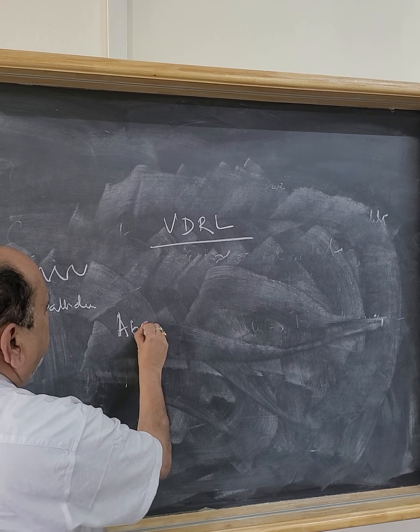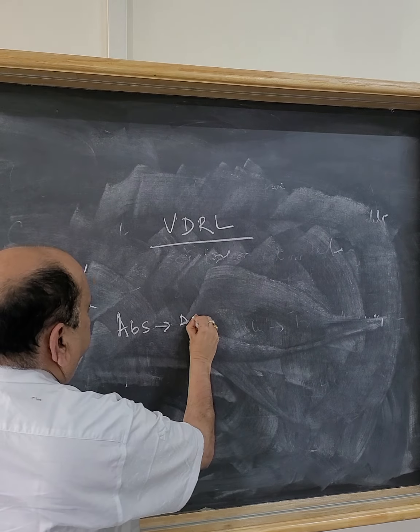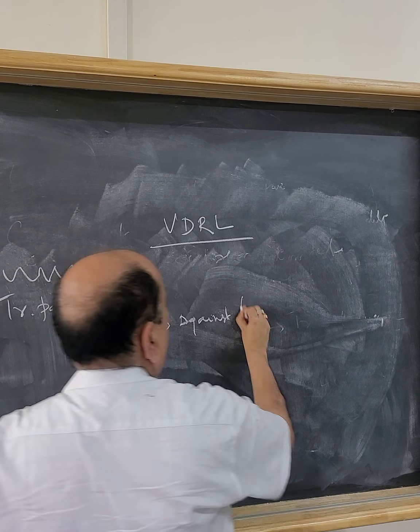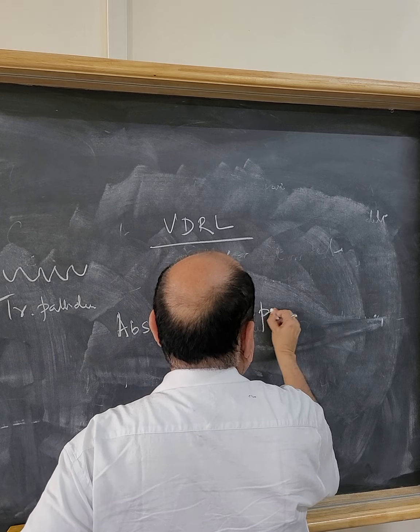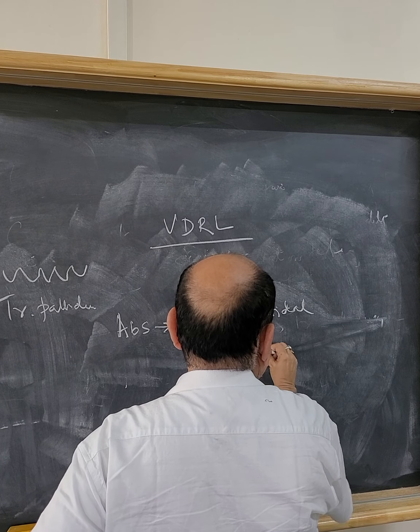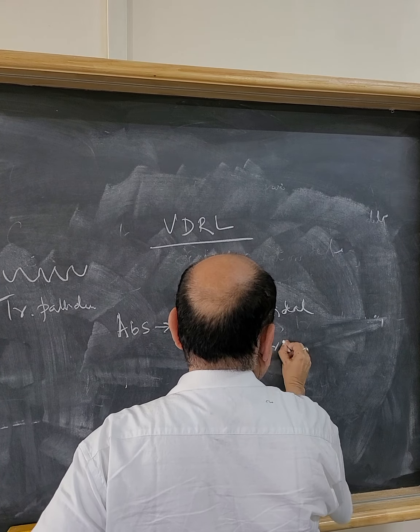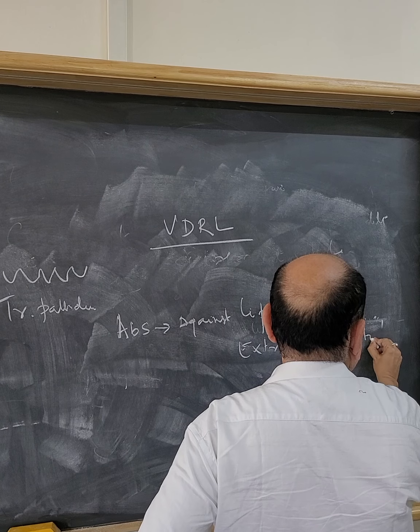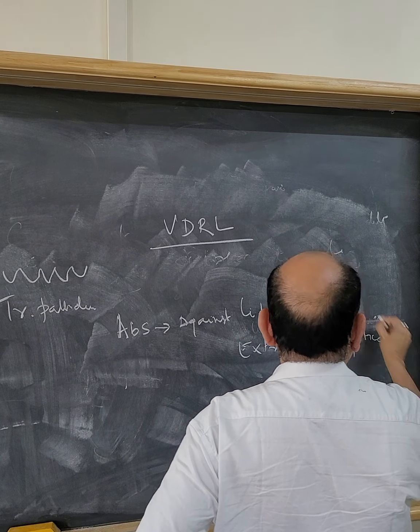Patient will have antibodies against lipoidal extract of beef's heart.